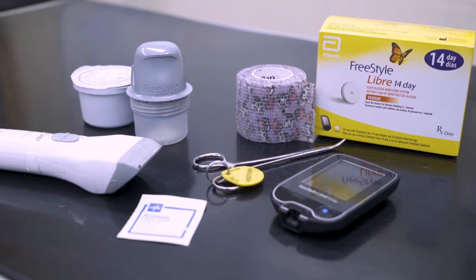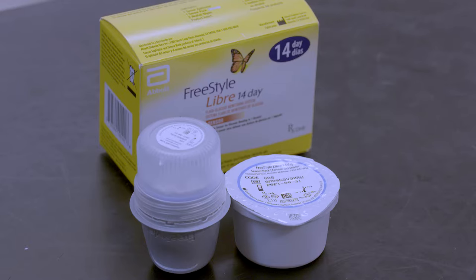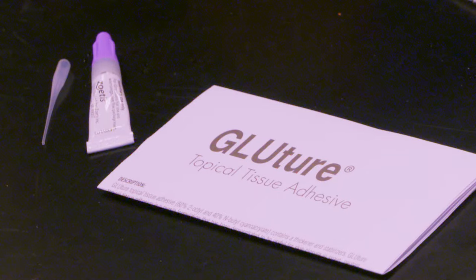To place the Freestyle Libre 14-day sensor, you will need the following supplies: a reader, a new sensor, a set of clippers, alcohol swabs, a pair of small hemostats, and a tube of tissue glue, such as Vet Bond or Gluture.